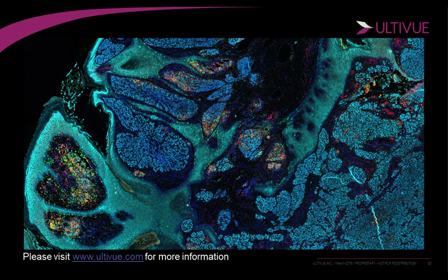And our signal over background is significantly higher than the background regardless. So when you're doing your threshold, having very specific and localized signal is something that will be very clear for you. It would be very difficult to do a straight quantitative assay if you have an antibody with extremely low binding efficiency. It may not be the best clone to be using in the first place. But as far as being able to detect over background, you should have no issues whatsoever.